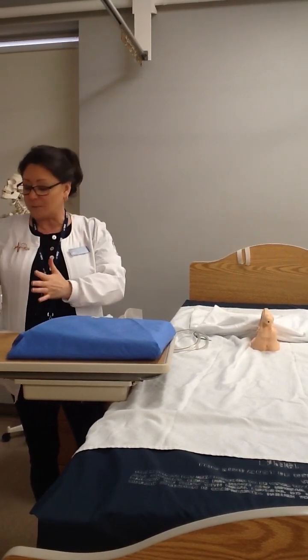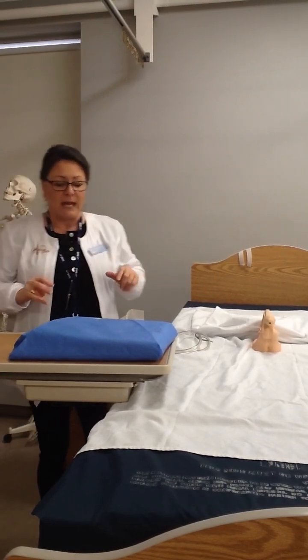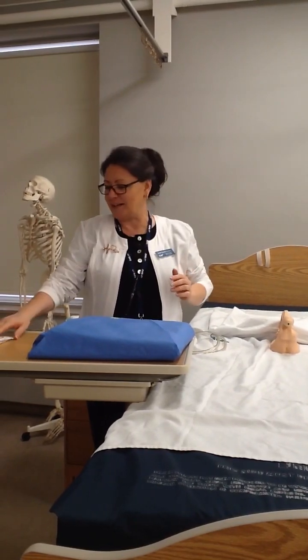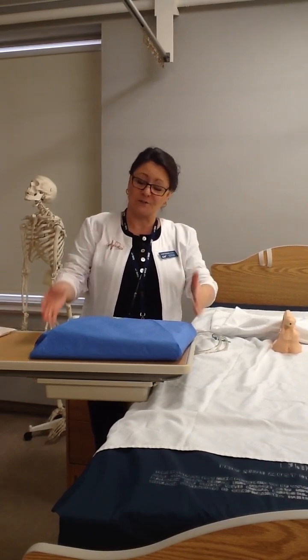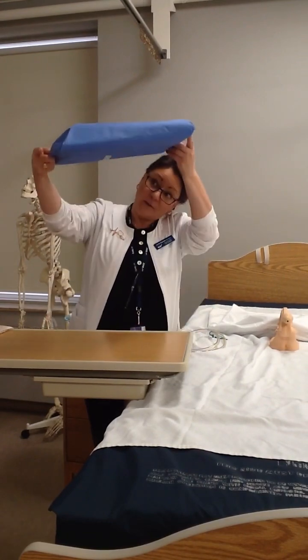So I have all my supplies assembled. I don't need this tape anymore. I can put that behind me too. And I'm ready to open up my tray. Normally this would move a lot more quickly, but because we're going through this step by step, it's probably going to be a little longer. So the first thing I'm going to do is make sure that my tray has no punctures or tears or watermarks, that the expiry is good. I'm looking on the bottom, looking all around it, and making sure that it's safe.